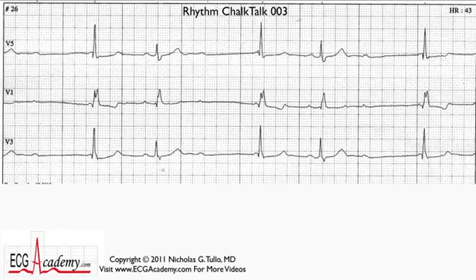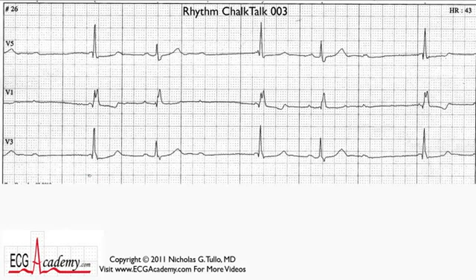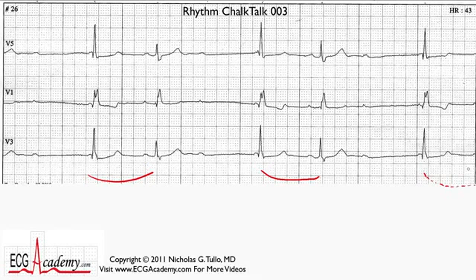Let's get to this. Remember to look at the forest. The first thing I see is that the QRSs are irregular. Look for a pattern. It turns out that these are regularly irregular with a group of two, and then a little pause and another group of two. And there's another QRS out here which you might think could be a group of two, but you don't know for sure. I'm trying to get you used to the fact that EKGs are not always perfect.